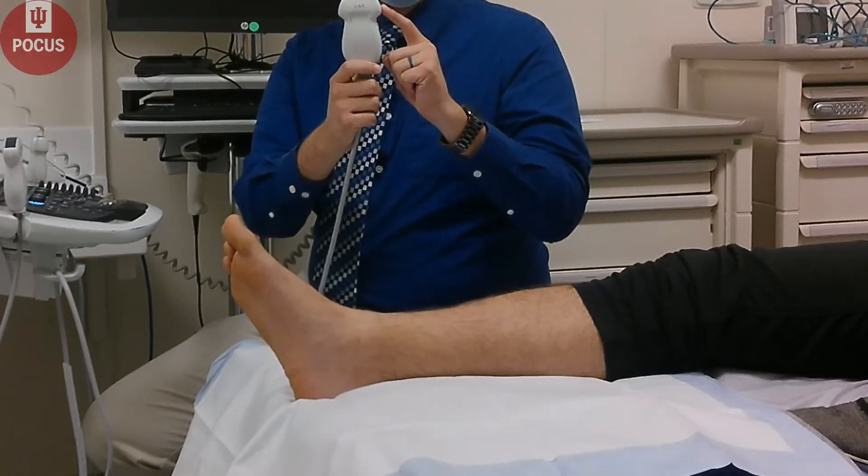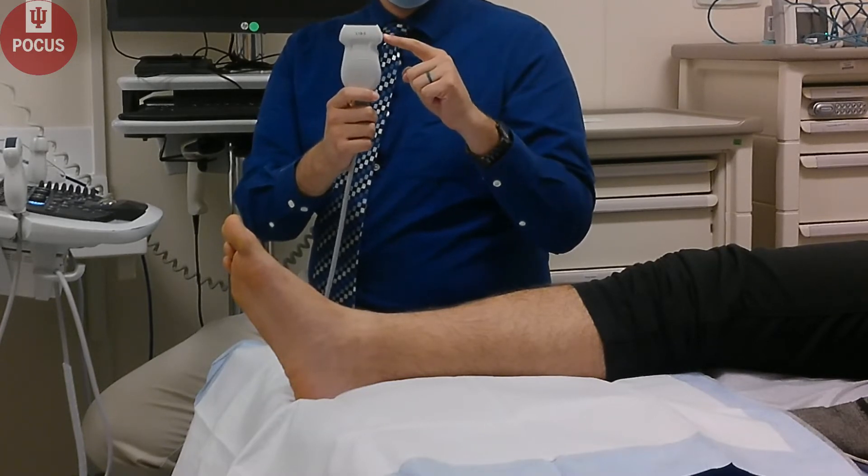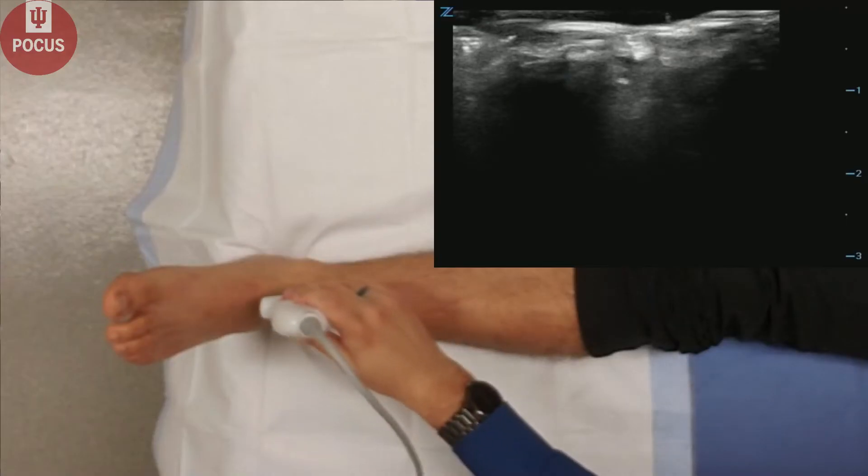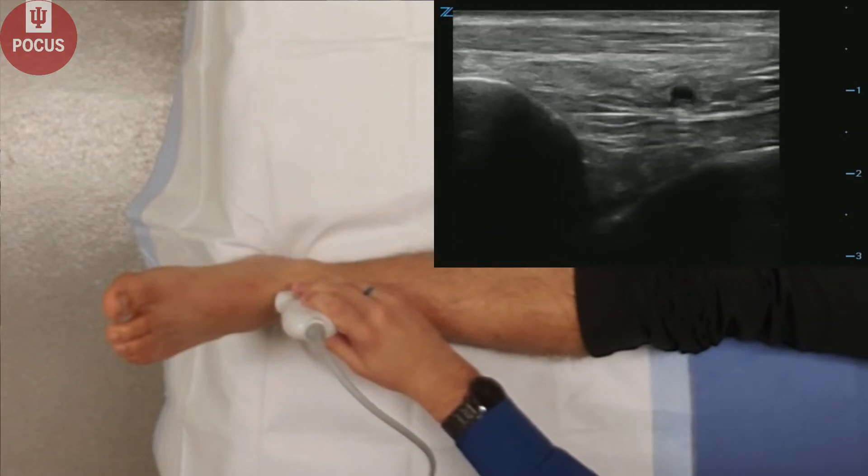Make sure that your marker dot is always pointing towards the patient's head or the right, or along the long axis with the structure you're looking at. First, we'll look at the anterior ankle joint in long axis.